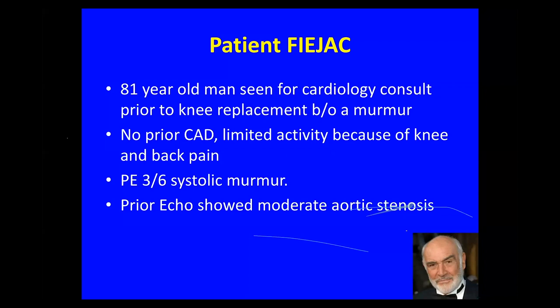It's high if the CFR value is around 1.5, 1.6, or lower than that. But that's something that we still would need to sort out. In our lab, using our software, we showed that if the CFR value is less than 1.8, you're more likely to have a benefit with revascularization, especially if you have a perfusion defect. So it may be related to significant obstructive disease in some sort, but there's no set cutoff for if the CFR is less than this, then you have obstructive disease versus not. 2 is the kind of magic number for normal, 2.0 ratio.